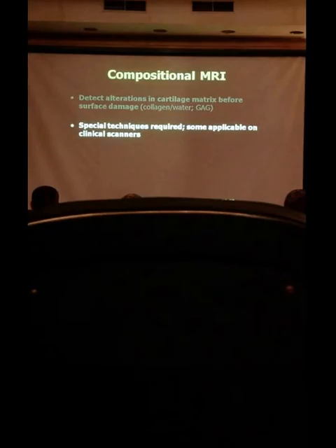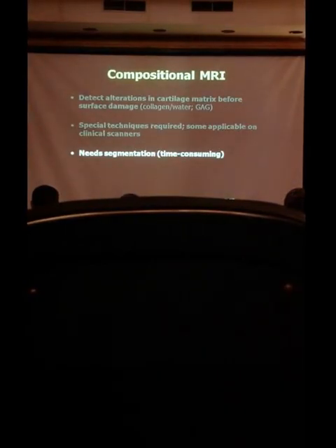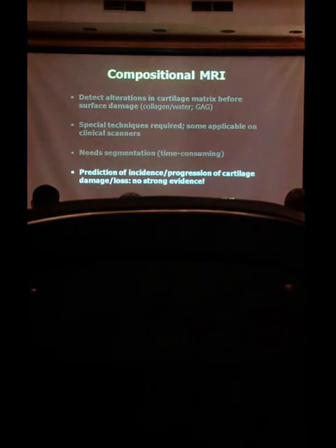Those are special techniques that require specialized software. Some of them are not applicable in clinical scanners. It needs segmentation, so it's very time consuming and very difficult to implement in clinical practice. This is often used for clinical research nowadays and less for clinical practice.